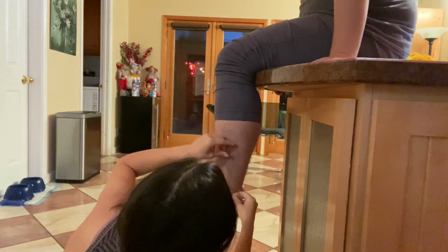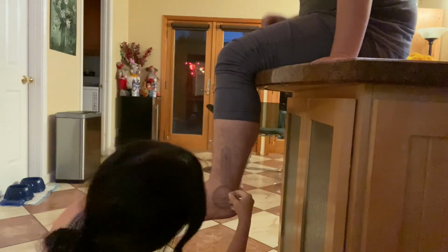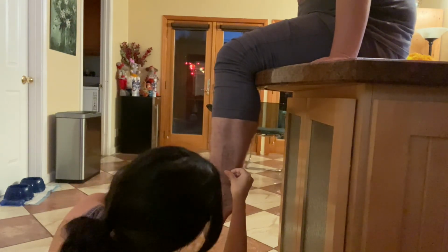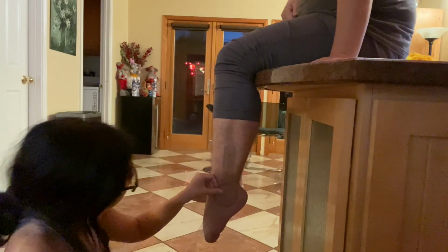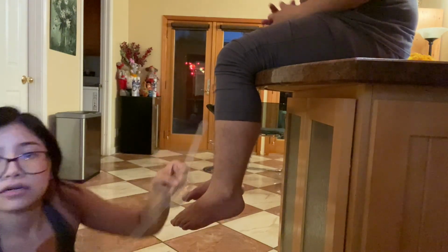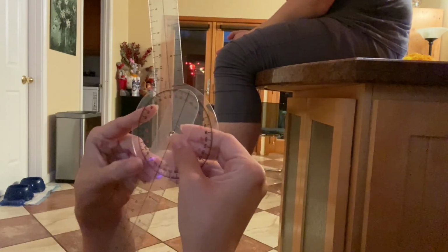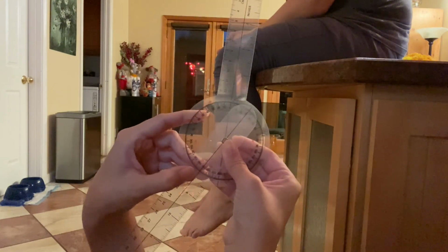So, I'm just going to move here. All right, now I'm going to ask the subject to point his feet towards the floor. And as you can see, it's lined parallel. Okay, thank you. And because we're starting at 90 degrees, and this reads at about 150, we know that the measurement is going to be 60.